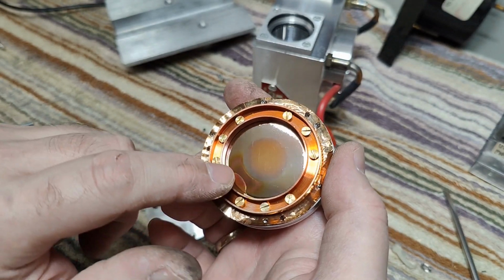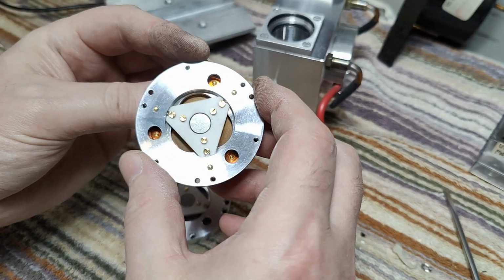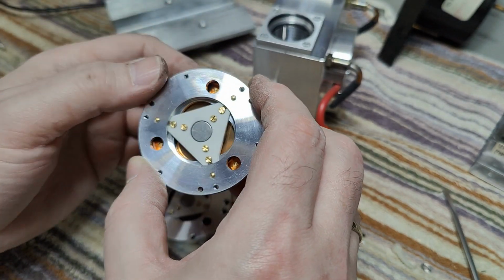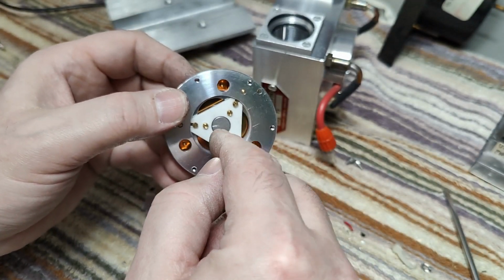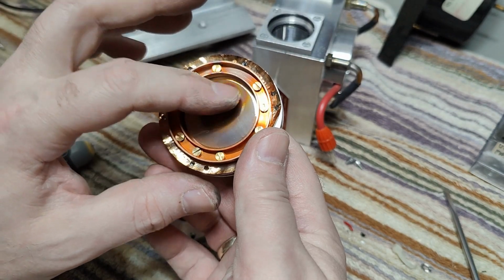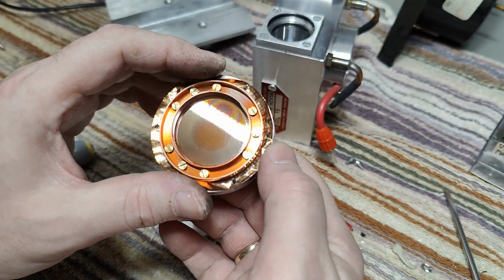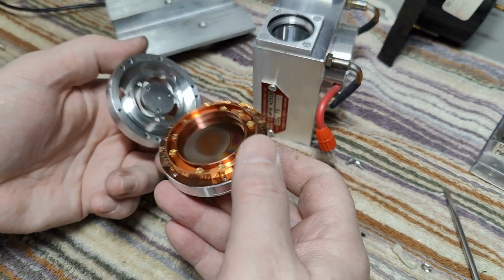This looks like it was blown through or something happened right here. See? In this hole here, so there's a short. I think those screws there are used to fine adjust the distances, and something happened to this. But here you go. Funny detector. So yeah, that is how it works.